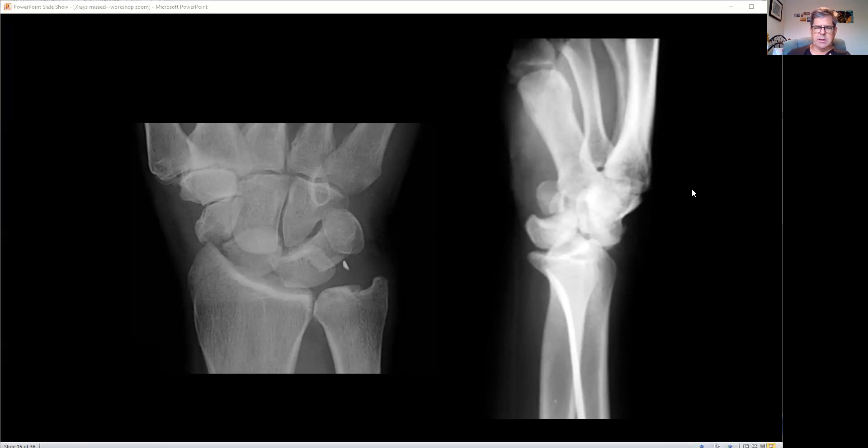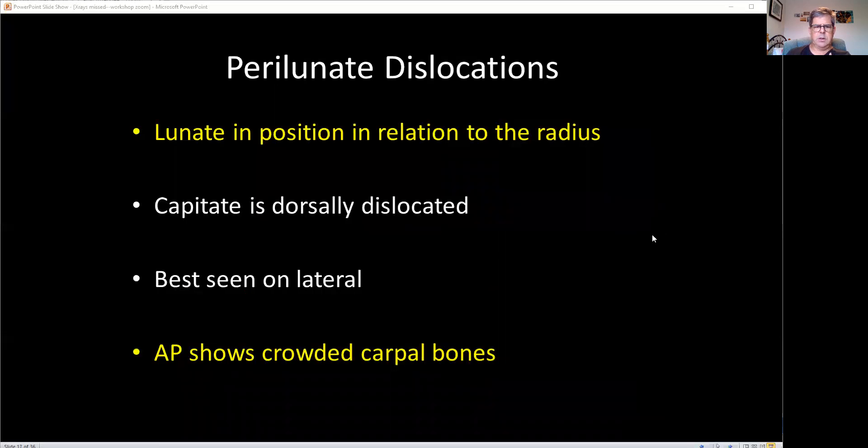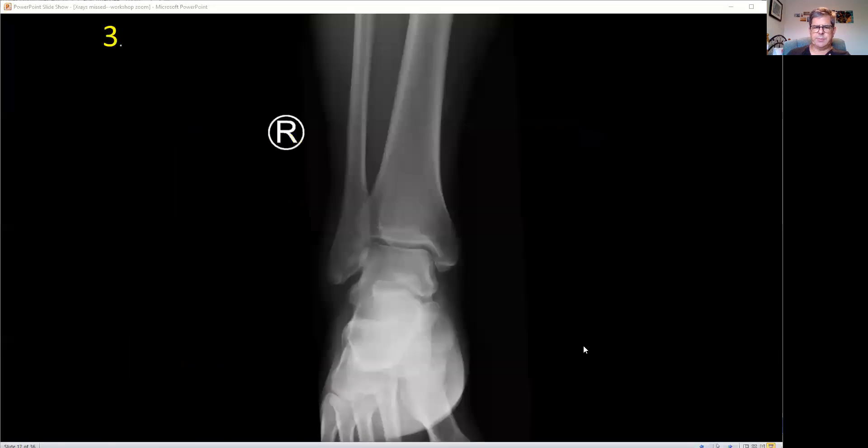So just to recap: for the perilunate dislocation, the lunate is in position on the lateral, and the AP shows a crowded carpus. Shouldn't miss that one.